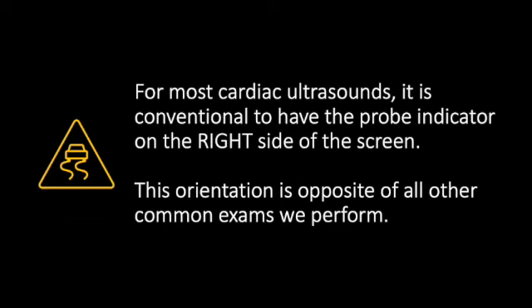Our first roadblock and potential pitfall when performing cardiac ultrasound is that there's a large deviation from convention here that applies uniquely to cardiac exams. Typically, you may remember that the probe orientation marker on the screen lies on the left side of the screen, which intuitively matches the orientation held by the probe being oriented towards the patient's right side. In other words, the way that you're looking at your probe and the way that you see your screen don't seem to be flipped or backwards. However, in cardiac ultrasound, this convention is flipped, so it does seem backwards.